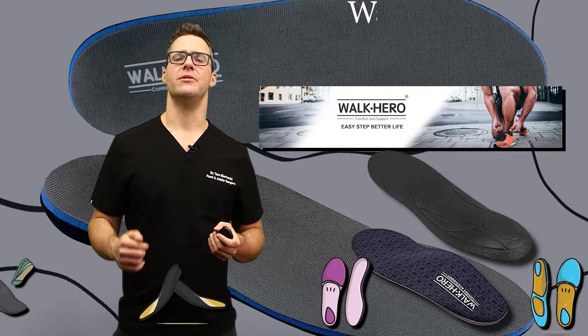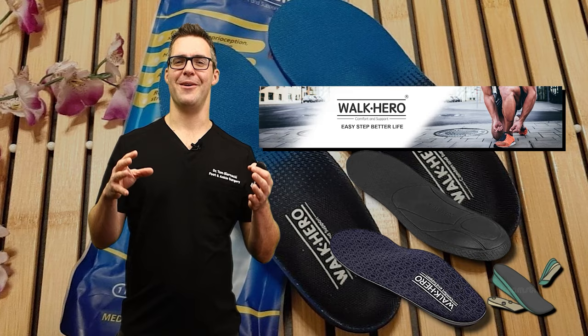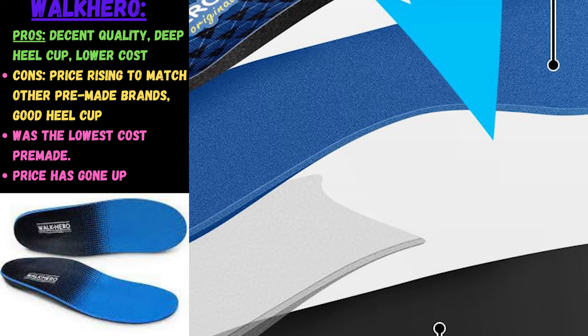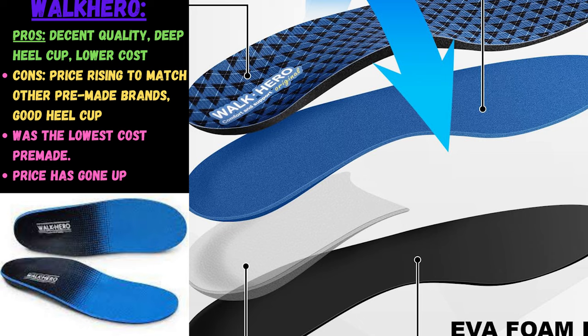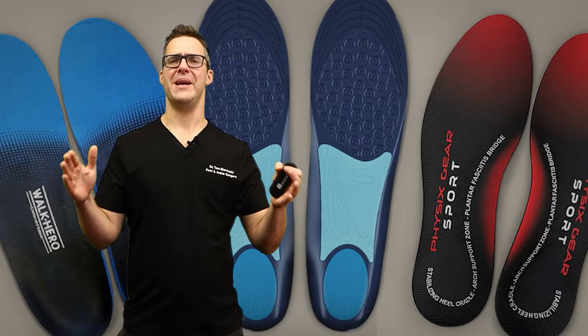Walk Hero is very popular online — kind of like the Chinese knockoff of PowerStep with slightly fewer options at a lower cost, though now they're going mainstream and raising their prices. Walk Hero used to be essentially the knockoff version of PowerStep for a much lower cost, but as they've gotten more popular they've risen to match PowerStep's exact cost. They're pretty comparable, and it's forced PowerStep to step up its game and add more features. Walk Hero is now more of a budget-but-rising-price version of PowerStep.